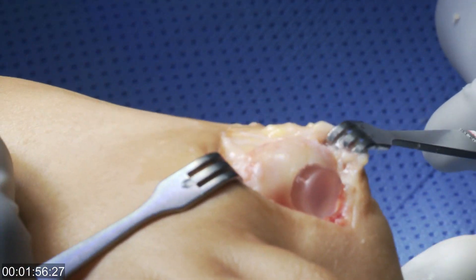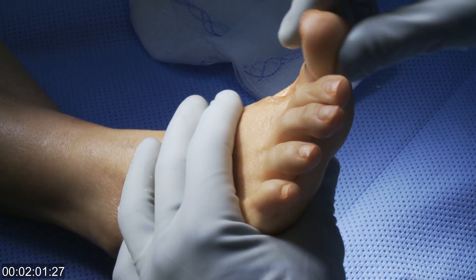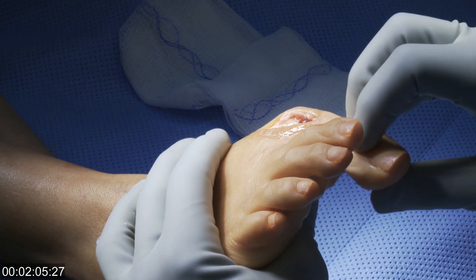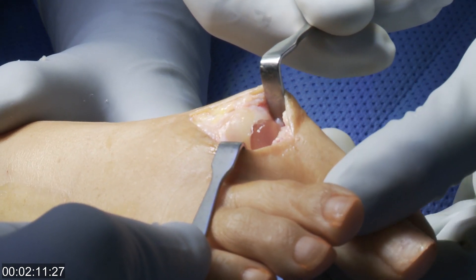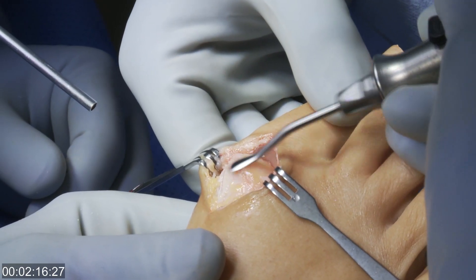You see it's implanted into the bone tunnel, and then it allows motion with the toe. The implant is about two to three millimeters proud in the joint, so it takes stress off of the metatarsal head where there was no remaining articular cartilage.